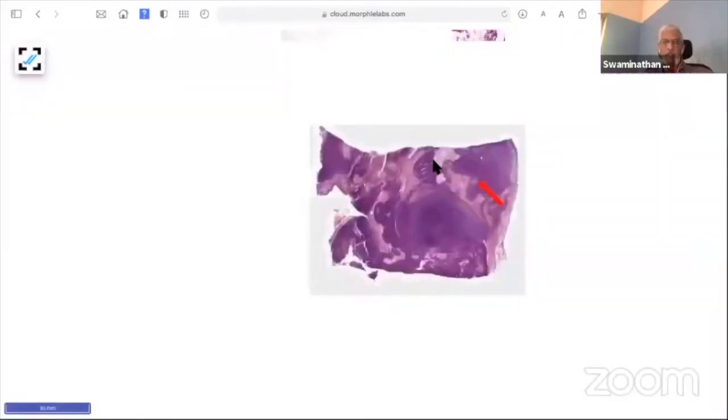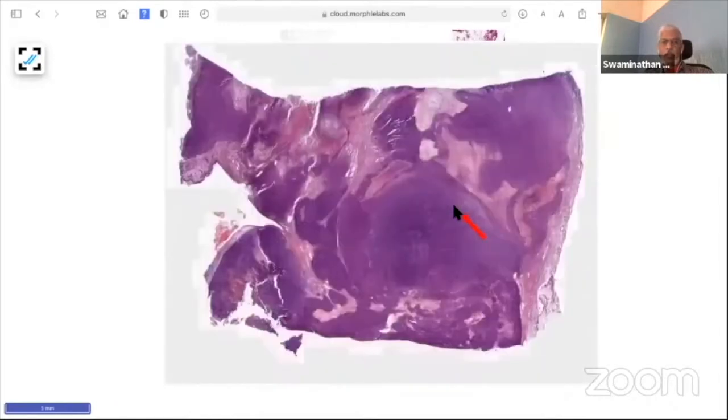And whenever there is hemorrhage and necrosis, you have to see it grossly and give the percentage. If grossly there is no hemorrhage and necrosis, but you see it microscopically, give it in this slide. For example, here I will give 25% or 30% hemorrhage and necrosis. And again, spindle cell tumor, never call any spindle cell lesion benign. Either it is low malignant potential or high malignant potential.